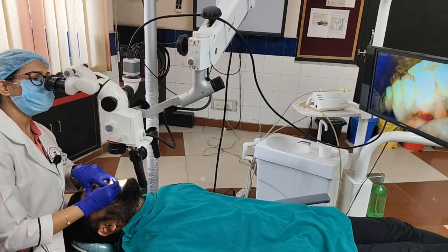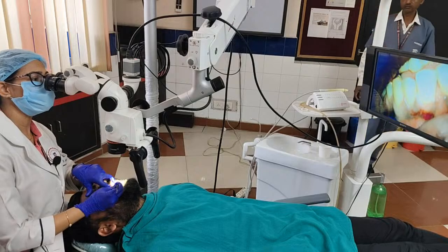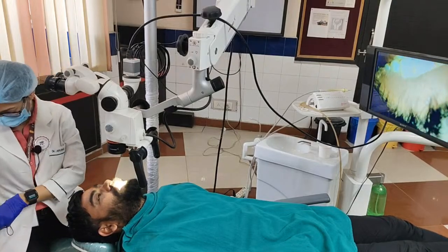Another thing, when you're doing scalpel depigmentation, most of the time what happens is your scalpel, see here, it's hardly working now. So it gets blunted. I need to change it. Just give me some time, I'll just change it. 2 minutes. Harendra ji, are you comfortable? Yes. Just 2 minutes.